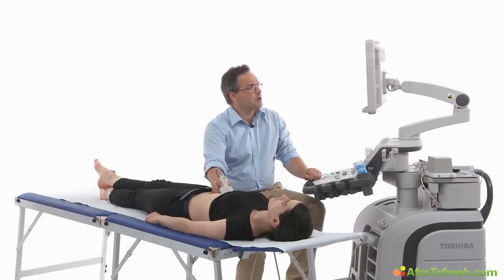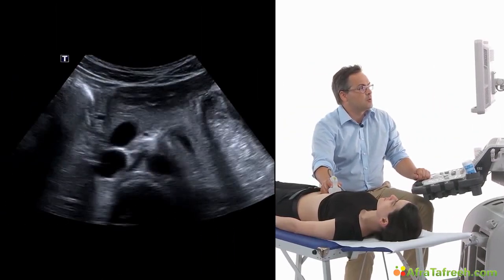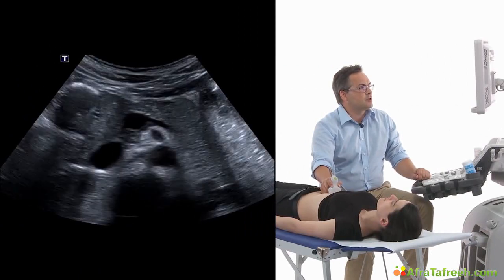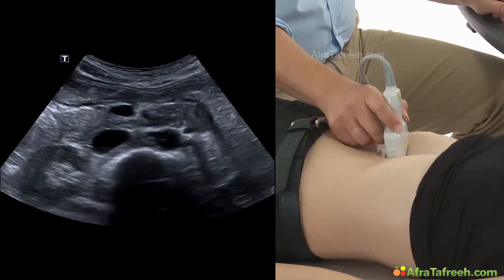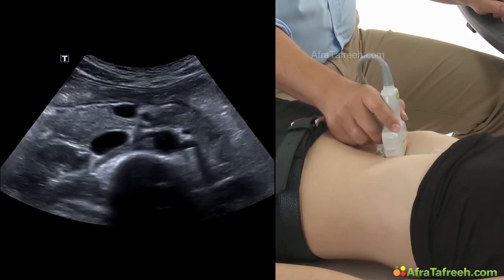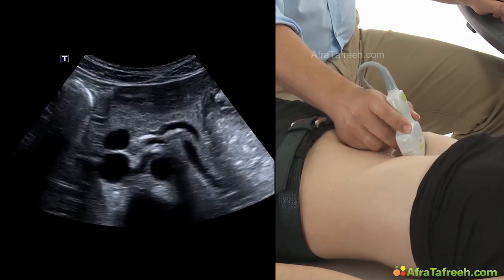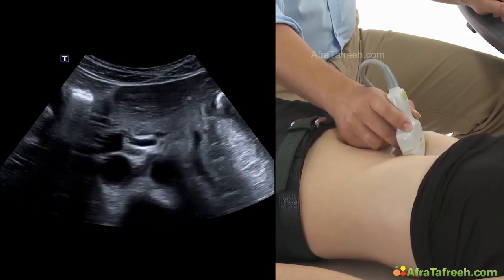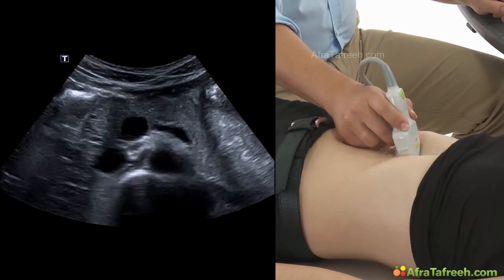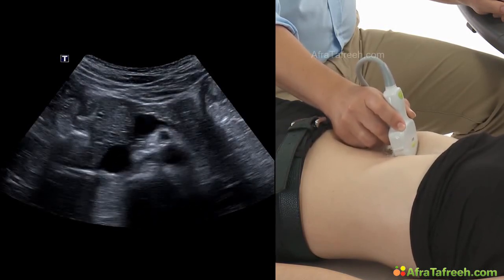The same way of scanning is used to find the renal arteries. We scan in the transverse scan, and when we follow the aorta from cranial to caudal, we first detect the celiac trunk. Then we can image the superior mesenteric artery.